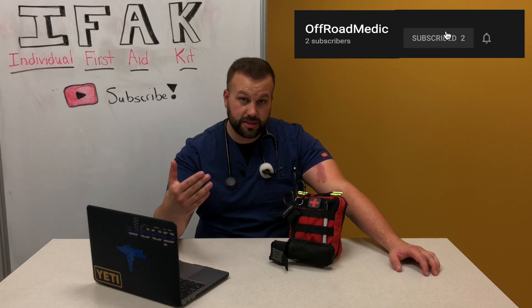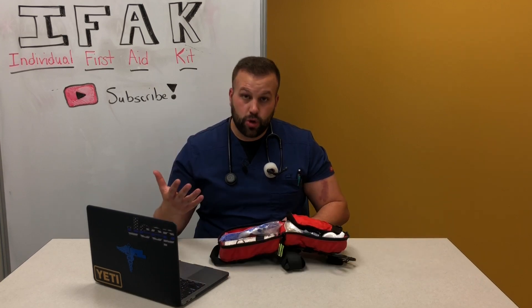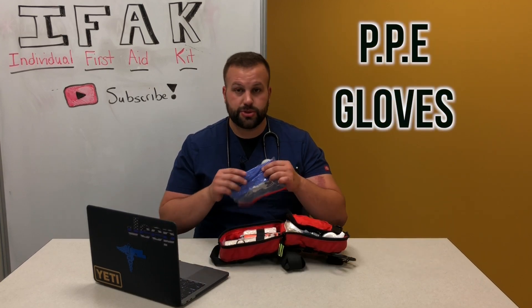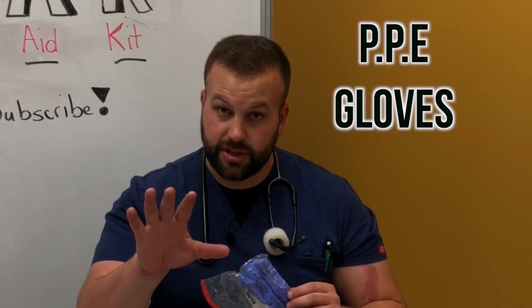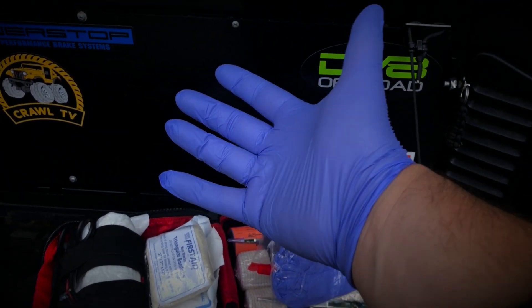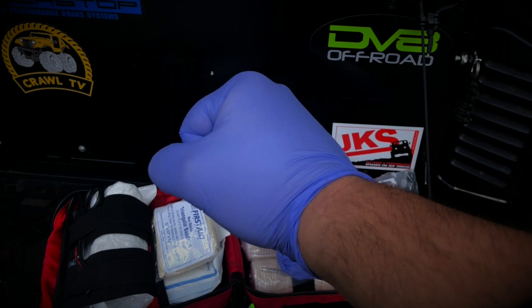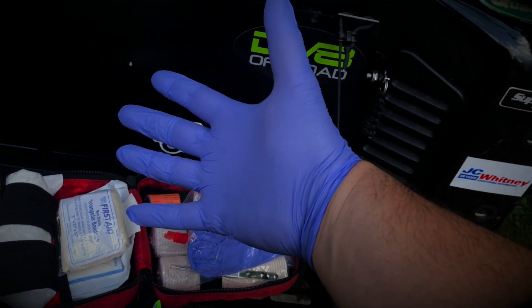Just know that every first aid kit should have a CAT tourniquet. Upon opening the kit, the first thing you're going to see is personal protective equipment — gloves. Every first aid kit should carry gloves; you've got to protect yourself. I prefer blue or black gloves because you can see blood on a blue glove — it's kind of hard to see blood on a black glove. Also in here: tweezers and scissors.